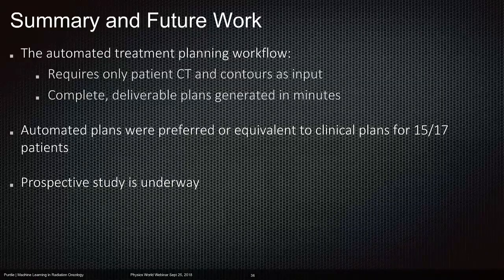The prediction is irrelevant, so the model will work, and then the mimicking will take advantage of the individual beam characteristics at your center to generate the final deliverable plan. So it will all work out that way.